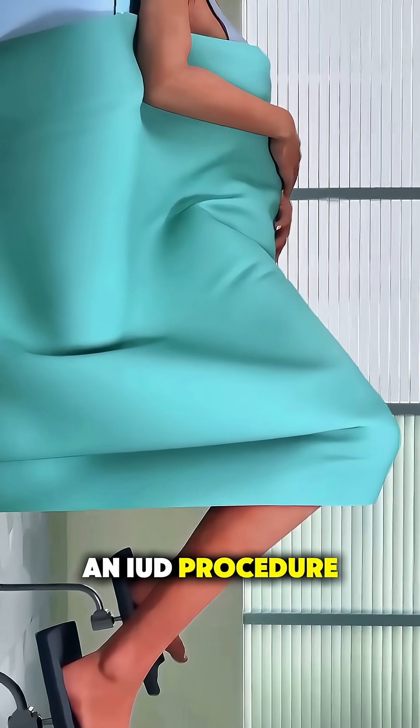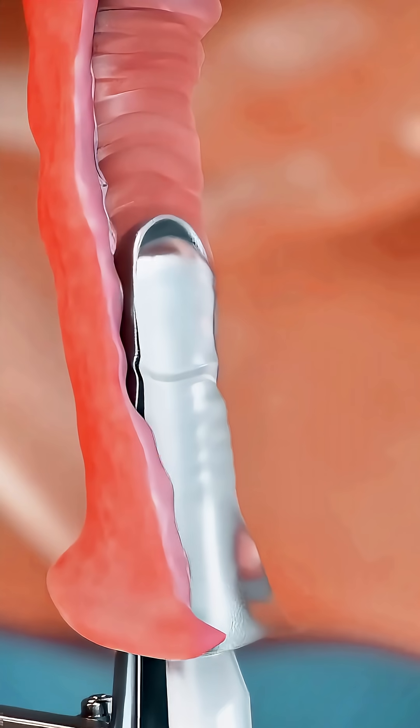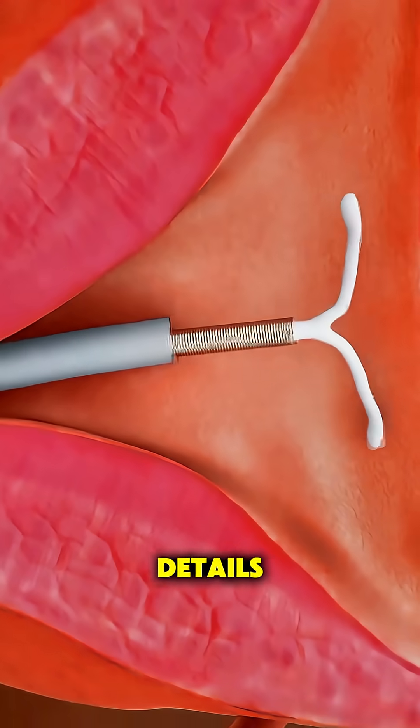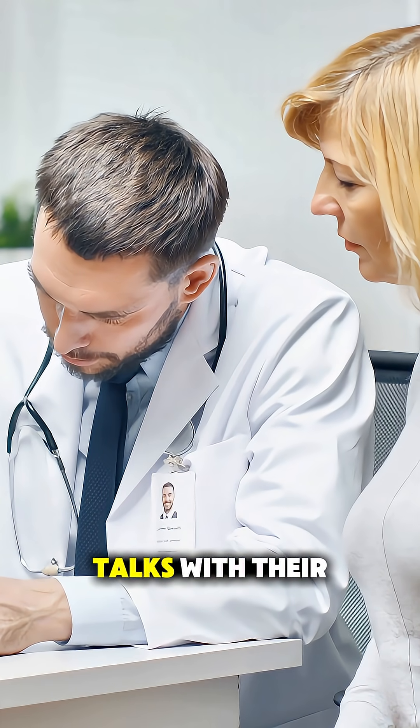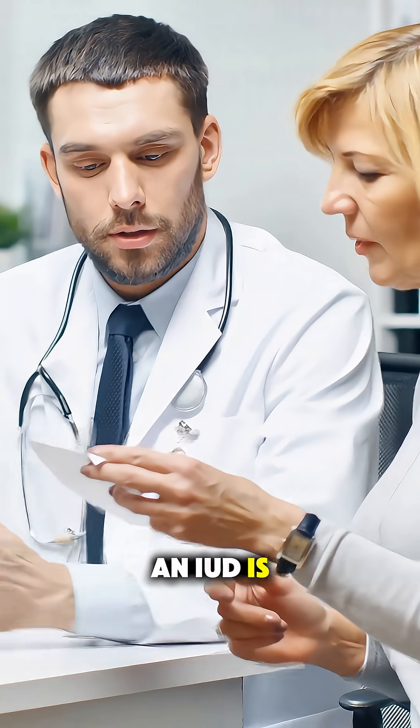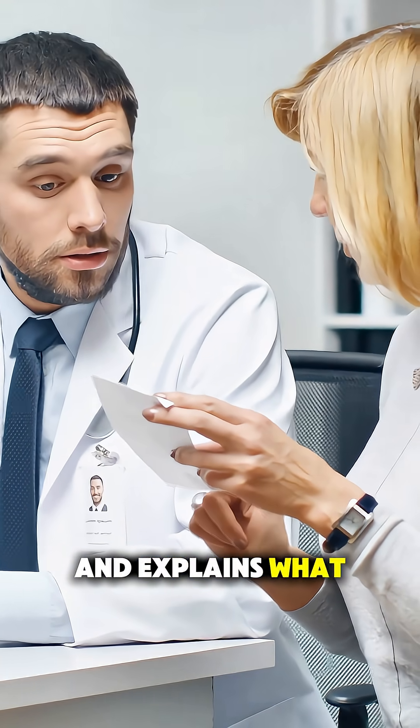Ever wonder how an IUD procedure is actually done? Here's a simple, calm breakdown so you know what really happens without any scary details. First, the patient talks with their healthcare provider, who makes sure an IUD is the right choice and explains what to expect.